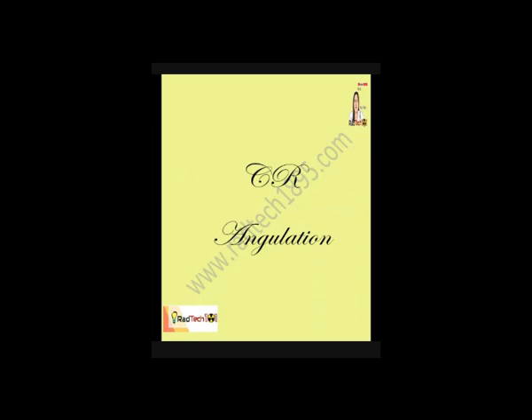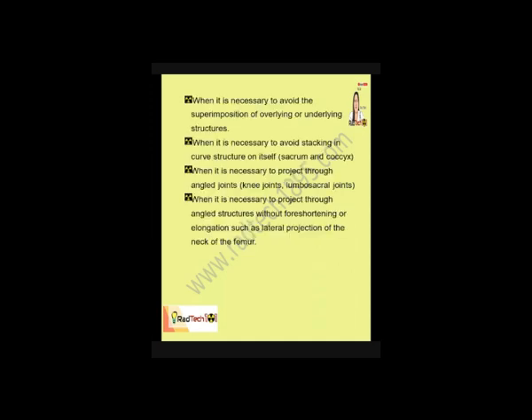Next, for central ray angulation. So, gumagamit tayo ng angulation ng central ray or ina-angulate natin yung tube during exposure para doon sa mga part na hindi makita using the regular exposure. Meron kasing halimbawa mga nakatago lang like yung mga joints. So kailangan hanapan natin ng magandang projection, magandang position para makita siya ng clear sa ating X-ray film.